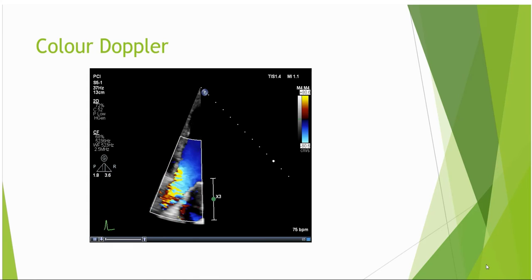Just like with 2D gain, we can significantly overgain and make the detail difficult for us to determine, or undergain, leading to loss of information displayed. Ideally, the gain should be adjusted for each new structure investigated and each new window we interrogate. It's unlikely one setting is sufficient for a scan, and a set and forget principle is less than desirable.